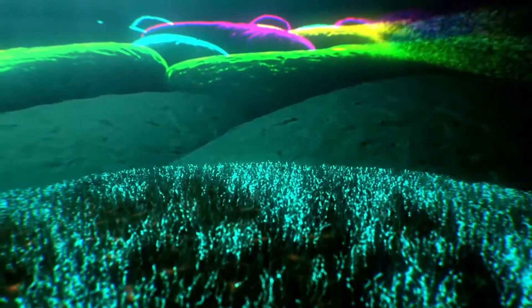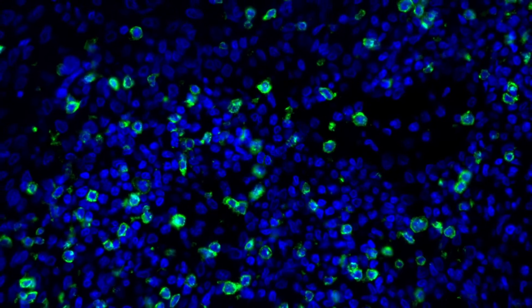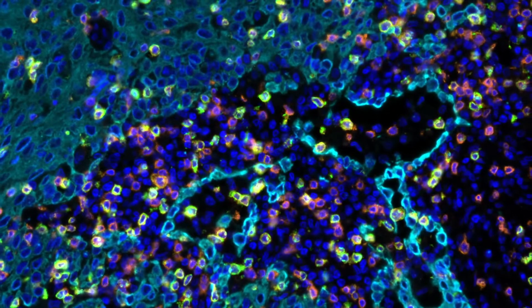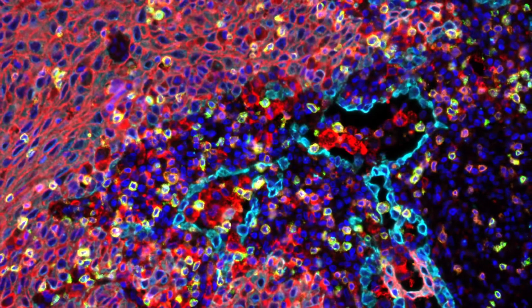Analysis software tools process the results to provide a comprehensive view of each unique sample, revealing deep biological insights into the immunological composition and spatial organization within a given tumor microenvironment.